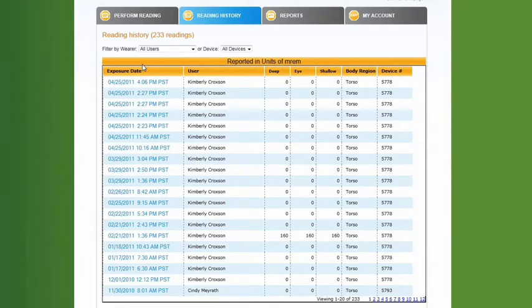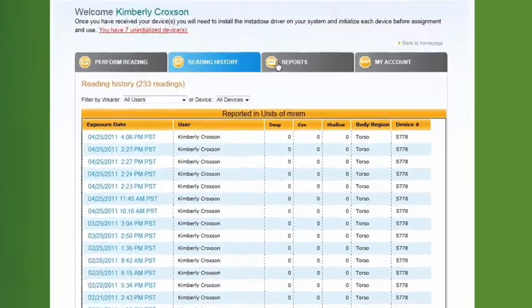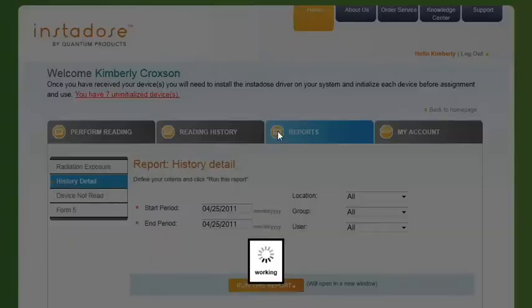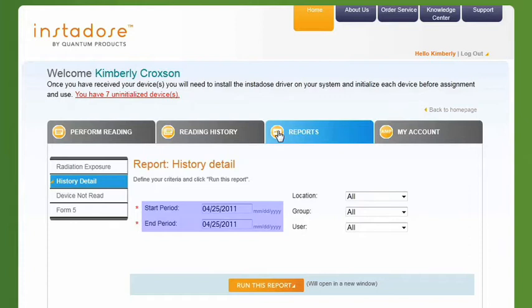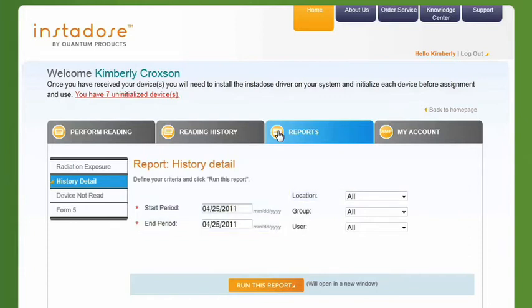Click on the Reports tab to view detailed reports. Reports can be run for an individual, group, a specified time period, by location, or for the entire account.